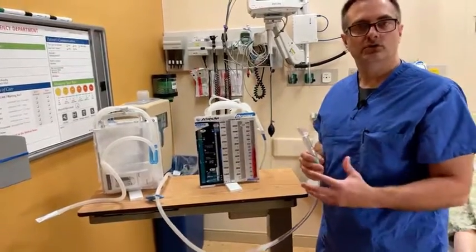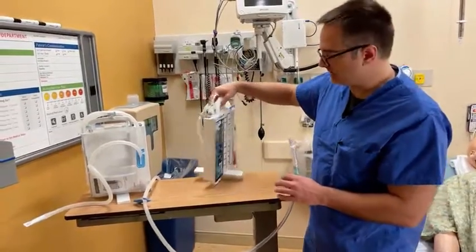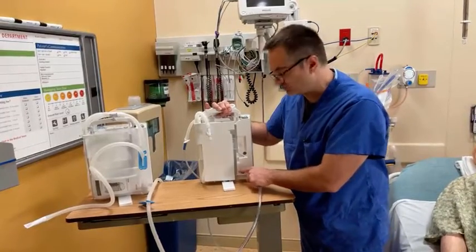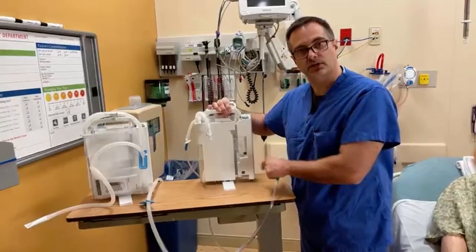Now, should you accidentally overfill the system, not to worry. On the back side of this, there are a couple of ports where you can use that syringe to withdraw the excess amount of fluid, both for the water seal chamber and for the suction control chamber.